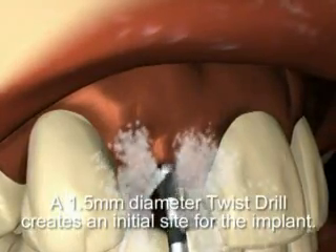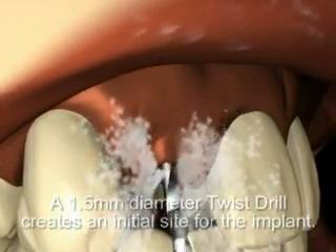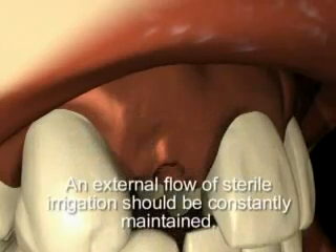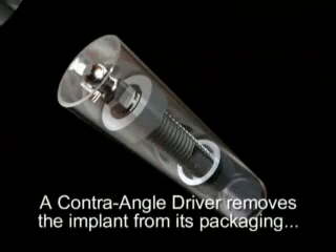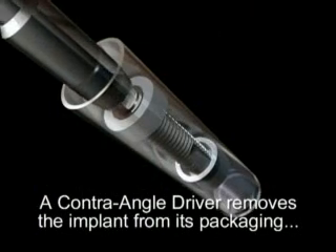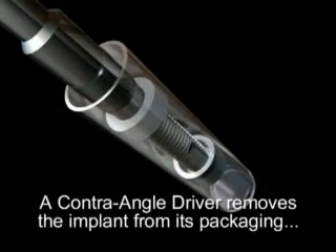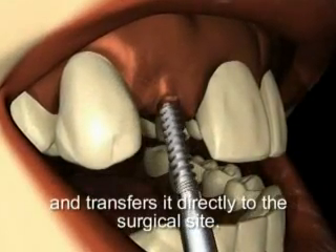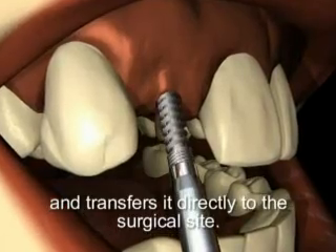The 1.5 millimeter diameter twist drill at 1000 to 2000 RPM creates a precise initial site for the implant. An external flow of sterile irrigation should be maintained. A contra angle driver attached to a slow speed handpiece slips over the o-ball, removes the implant from its sterile packaging, and transfers it directly to the surgical site for seating at 15 RPM or less.